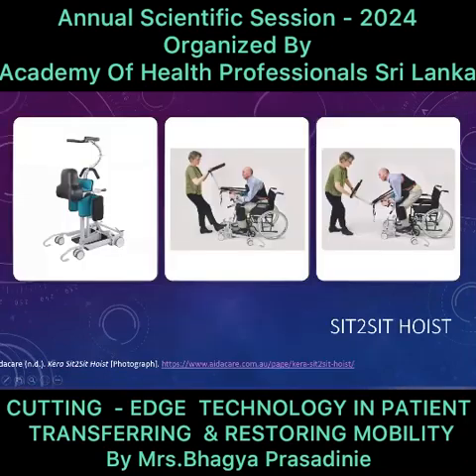So the next one we are moving on is the sit hoist. This one is purely manual, and again, this does not need any power or electricity. This is purely lever based. As you can see, the carer is pushing the lever down, pushing the handle down, so that the resident is coming up.